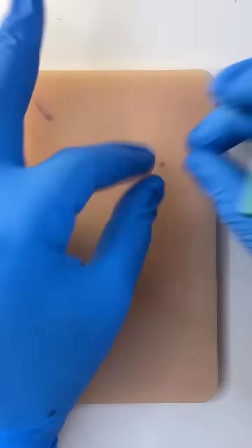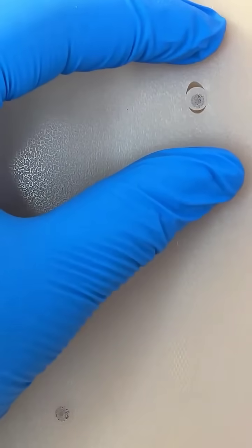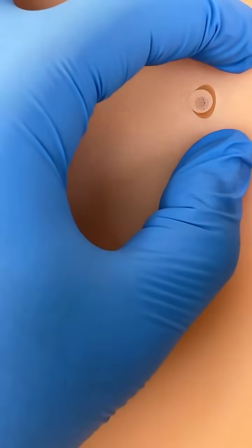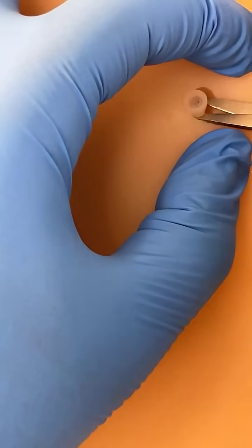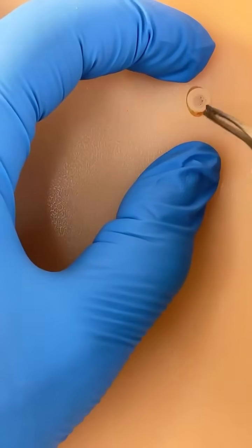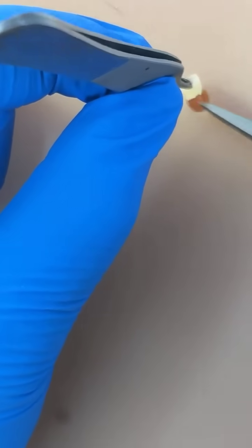So it looks like I haven't done anything — I have. The next top tip: apply distracting force and then get your scissor and go to the base. I'm doing this because I don't want to crush the specimen, which you do easily if you take a forcep to it. You just want it to pop up, then get one part and finish it off.